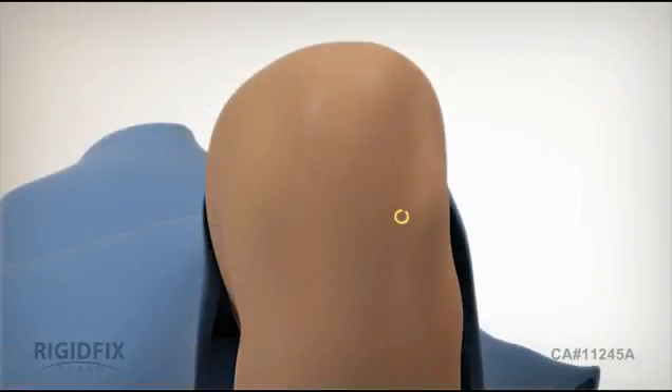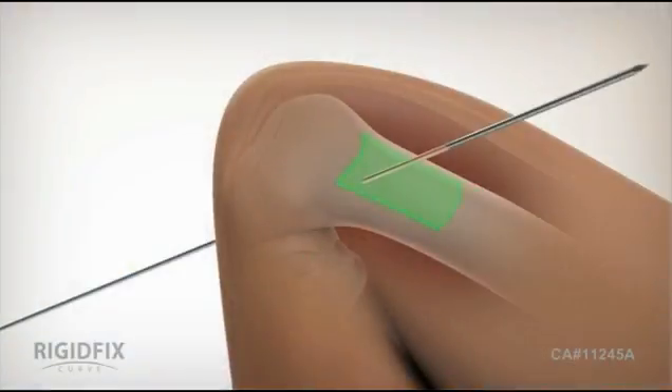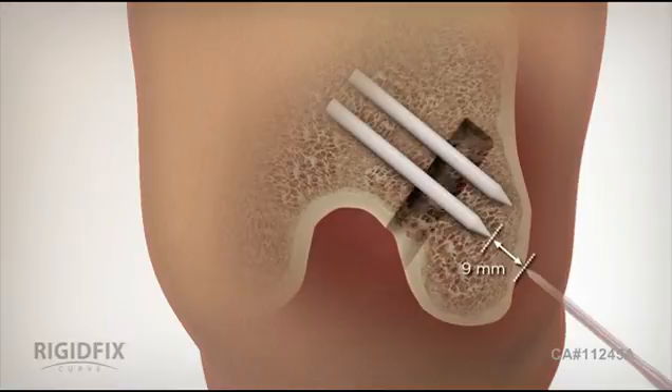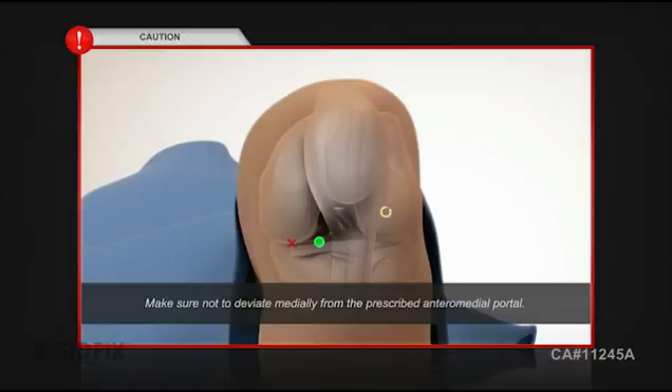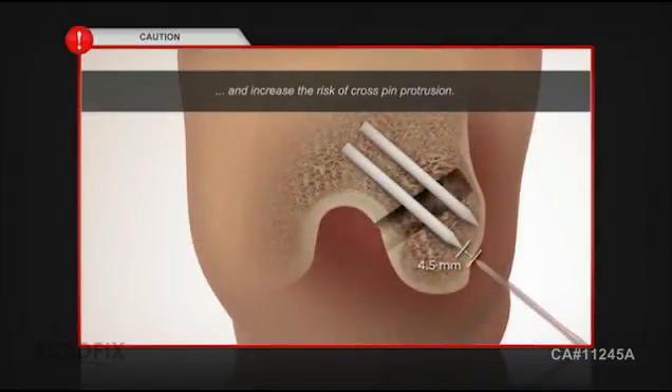Next, establish a standard anterolateral viewing portal. Then, using a spinal needle, establish a low anteromedial portal that will be used to drill the femoral tunnel. The correct placement for this portal is distal to the inferior pole of the patella, superior to the medial meniscus, and just medial to the medial edge of the patella tendon. This prescribed anteromedial portal placement will maximize the lateral bone stock for cross pin insertion. Lateral bone stock is the distance between the tip of the pins and the lateral femoral cortex. CAUTION: Placement of the anteromedial drilling portal is most critical. Make sure not to deviate medially from the prescribed anteromedial portal, as this will reduce lateral bone stock and increase the risk of cross pin protrusion.